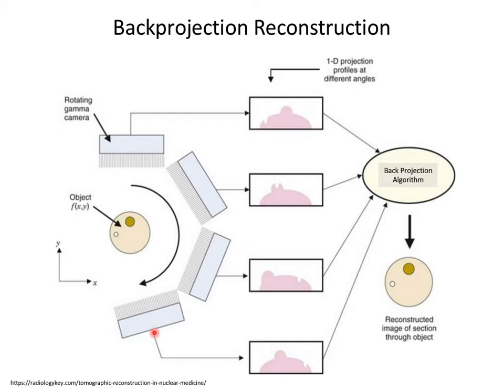That's a pretty wide open question. Yeah. Depends on what resolution you want. Exactly. So I can make a picture with 2 projections, right? But the resolution of that picture is going to be pretty low, right? Because in one projection, I know I have a bright object. It's somewhere along this line, right? In my second projection, let's say I make my projection at 90 degrees just for the fun of it. It's somewhere along this line, right? That's basically all I know.